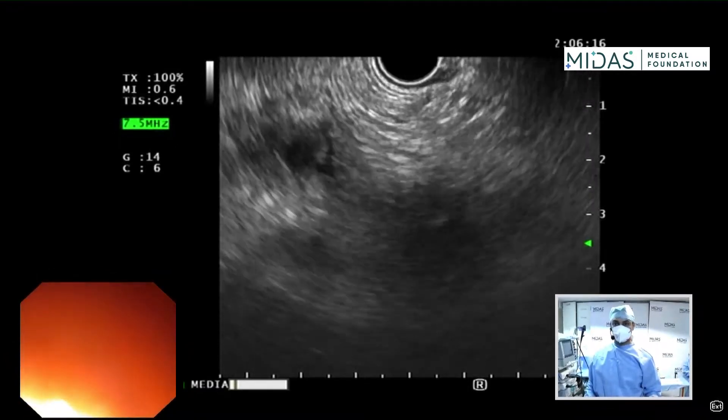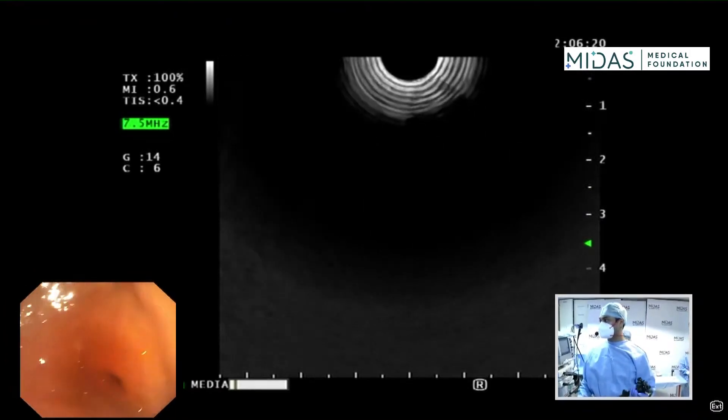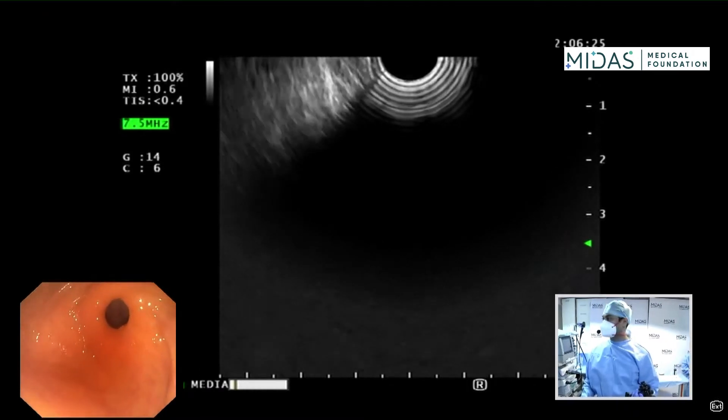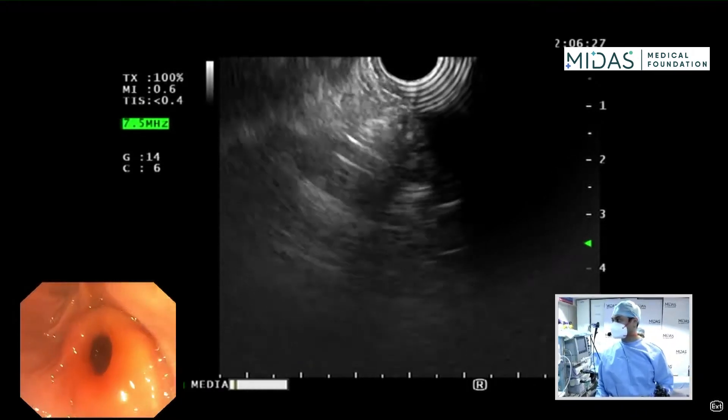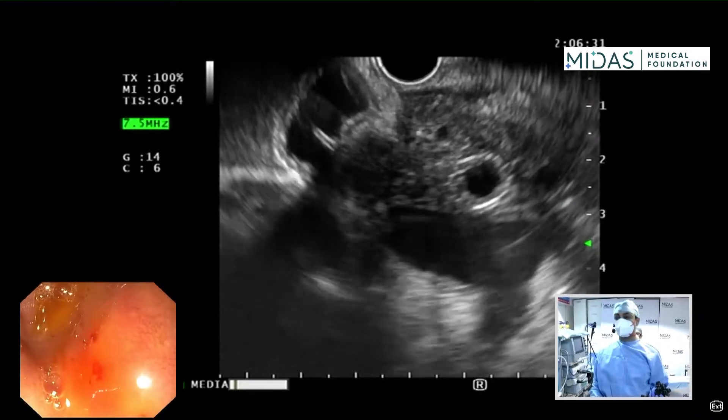My scope is in the stomach. I'm advancing the scope towards the gastric antrum and I'm going to suction all the air out, then eventually intubate the pylorus. I'm suctioning the air and I've intubated the pylorus. Now I'm in the duodenal bulb.